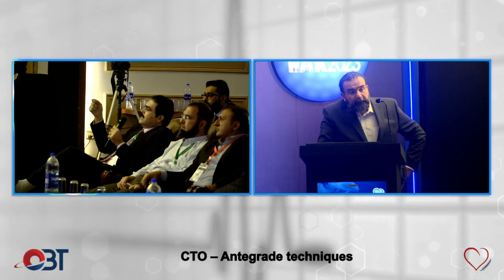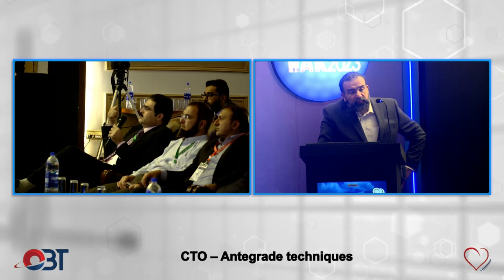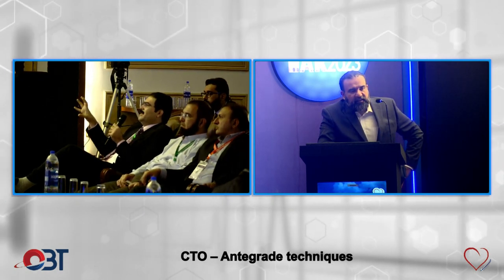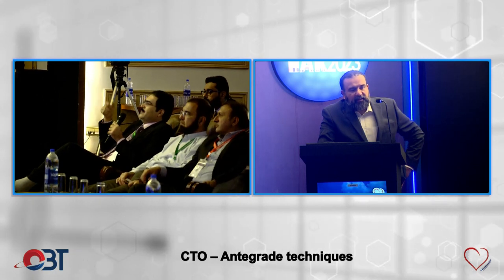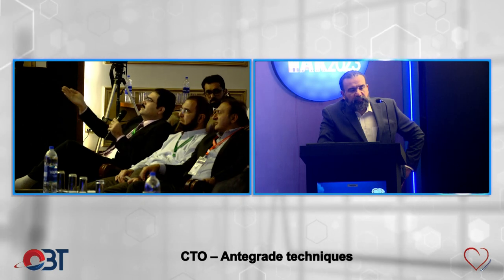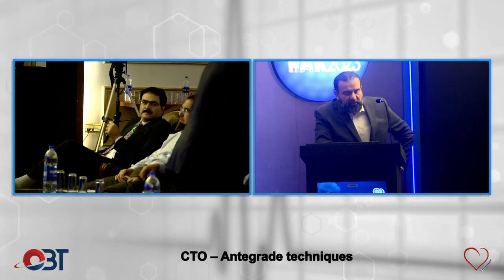It's something which I got through doing Carlino. In the Carlino technique, when you pull the plunger back of the syringe, there will be no free blood coming into the syringe. It is Carlino, typical Carlino. If the blood is freely coming, then it's a tip injection, either proximal or distal to the cap. That's a very good point. Actually, you're absolutely right.